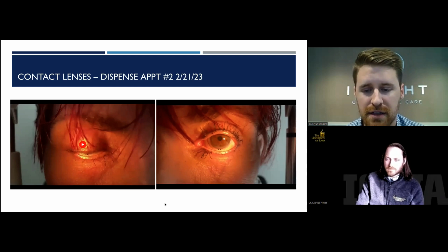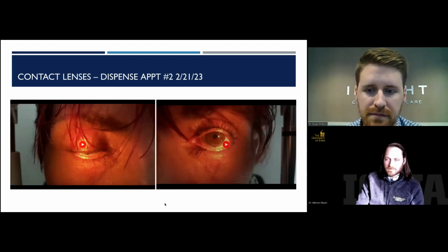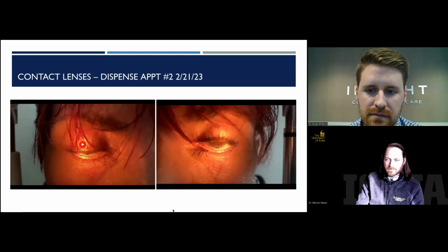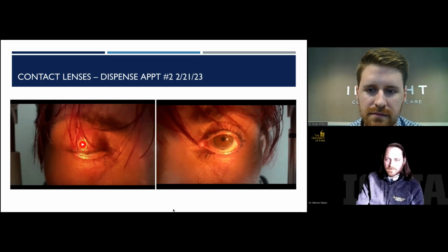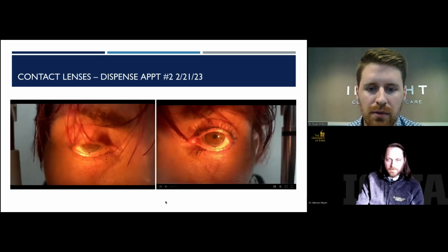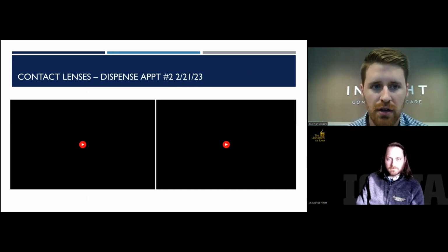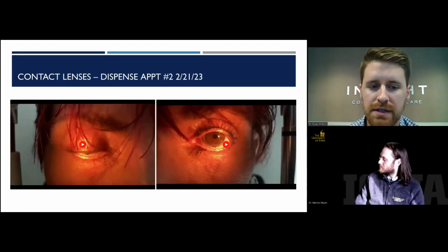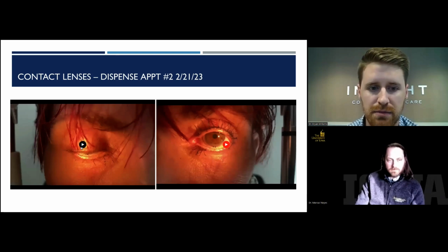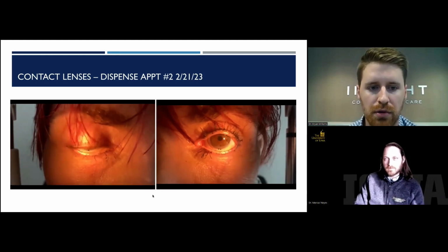Even a little bit less. So she's very clear on that pupil on most of her blinks there in the left eye. All right, but with the lenses in place, she was reporting comfortable, clear vision, and she called about a week later. This one is still in the process of a follow-up visit, but about a week later, she said she was much more adept at putting the lenses in, taking them out, and they were working pretty well for her.